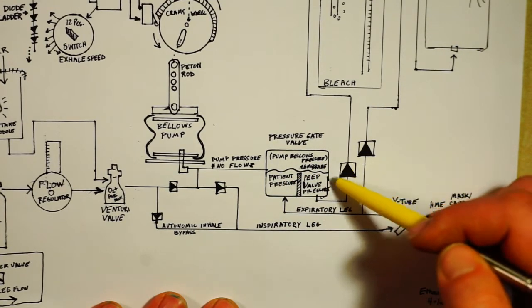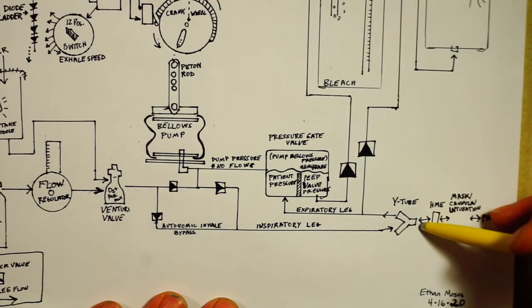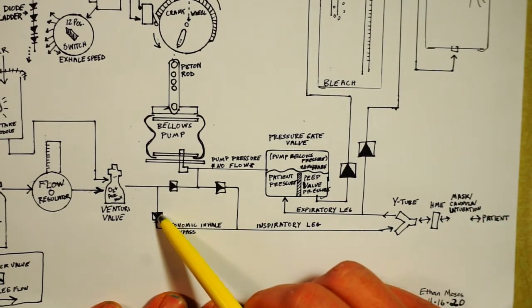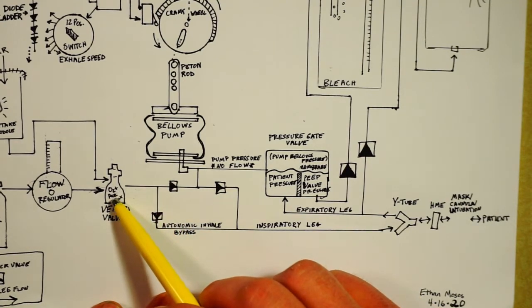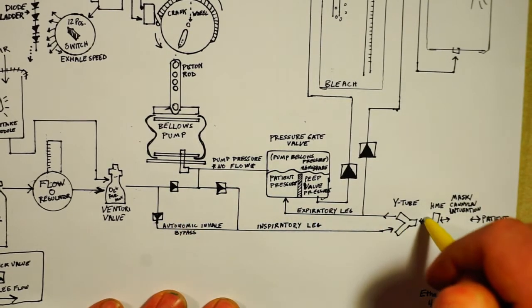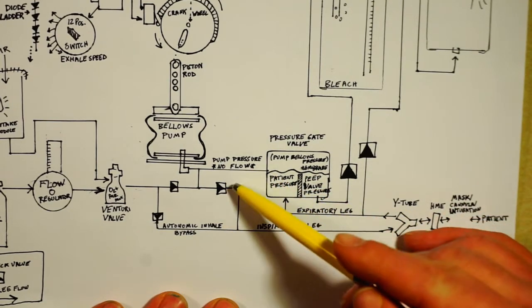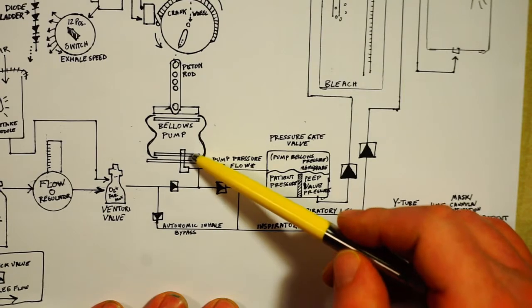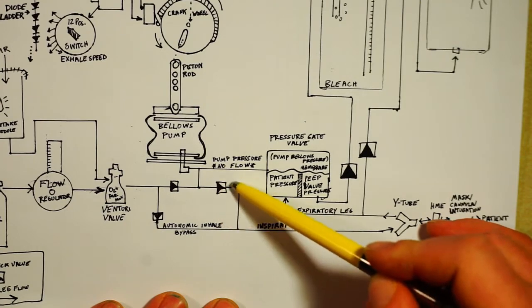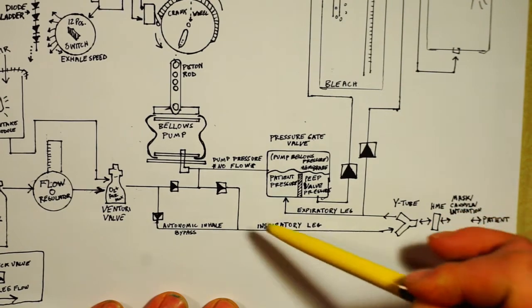this chamber would be sucked closed, and this check valve would also be sucked closed, as with this, and the patient would have nowhere to breathe from. So what we've done is add another check valve here that goes directly to the Venturi mixer to allow that patient to inhale through this leg of the system. Now, at slower speeds, the patient maybe could create enough suction to open this check valve such that while the pump is inhaling, it's inhaling through here, but this check valve would still open, allowing the patient to inhale through this valve.